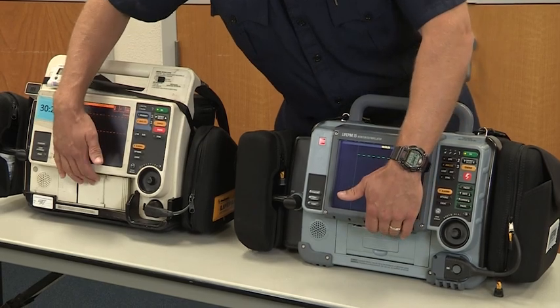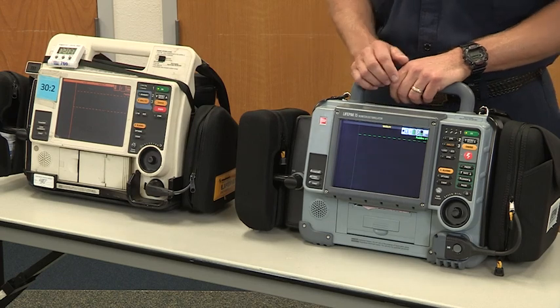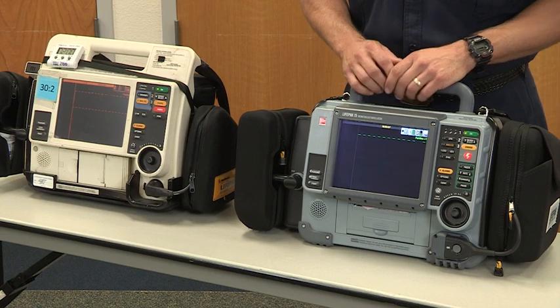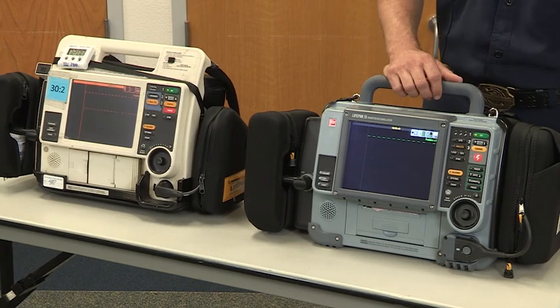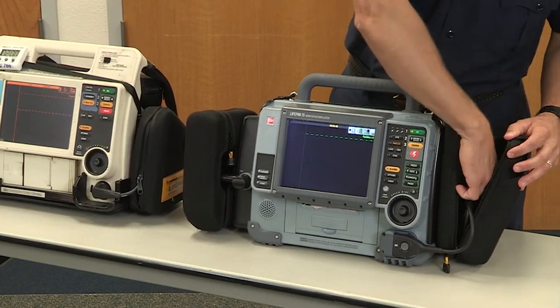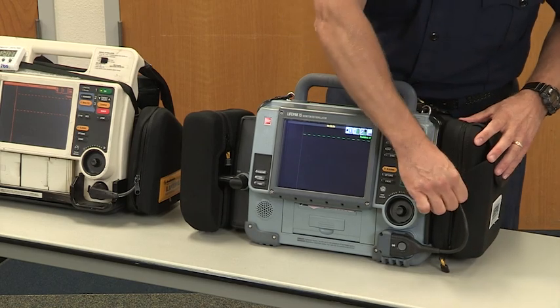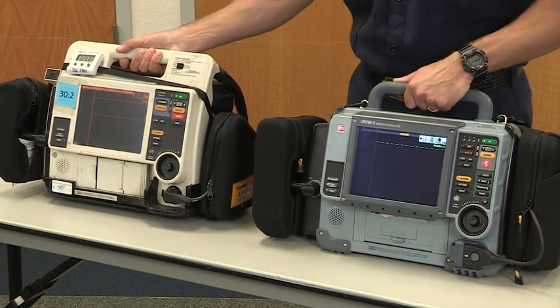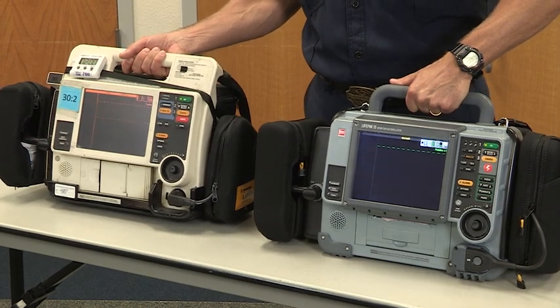The paper tape is still located in the same spot on either machine. However, the LIFEPAK 15 has the wide pink paper tape versus the small, narrow green and white tape. And later on during the daily check, I'll show you how to make that change as well, although most of us should know how to do that from using the Medix machine. Our shock cables are located on the same side on the LIFEPAK 15 as they are on the LIFEPAK 12. So by and large, you'll see that Physio-Control has done a great job in keeping consistency between the LIFEPAK 12 and LIFEPAK 15.